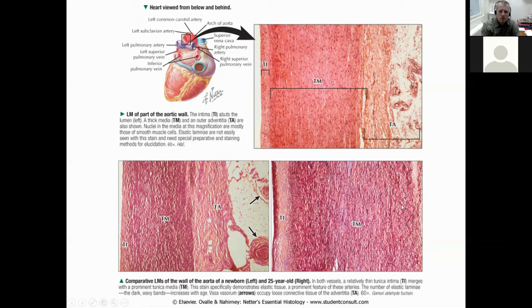So you can see that as we age, our body grows, the arteries also grow, and there is a difference not only in thickening of the intima, which is part of the aging that affects our arteries, but how much thicker the media is, because we have many more lamellar units with the sandwich arrangement of elastin, collagen, smooth muscle, and so on. So in this adult individual, there will be maybe 45 lamellar units. This is a typical elastic artery, okay?